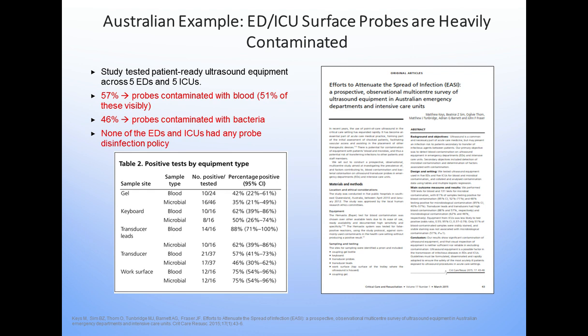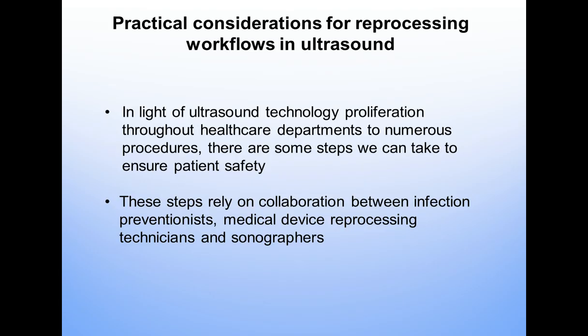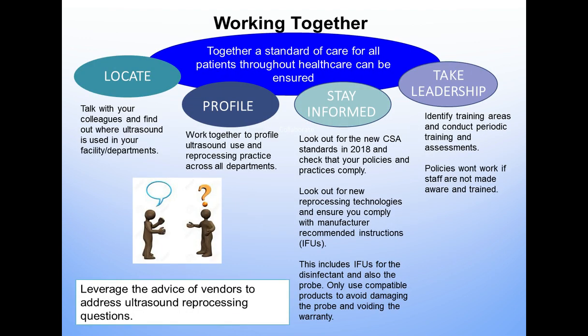Traditionally we think about high-level disinfection of endocavitary probes, and that is quite well understood. But as the use of surface probes has expanded, there's a large variety of procedures across many departments which need to be addressed. So I think I just made this point, but these steps really rely on collaboration between various stakeholders here: infection preventionists, medical device reprocessing experts, and sonographers and physicians.